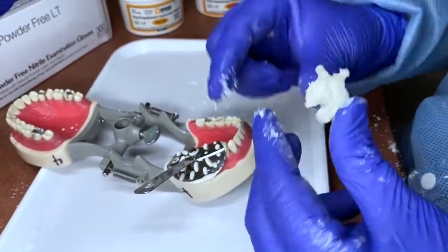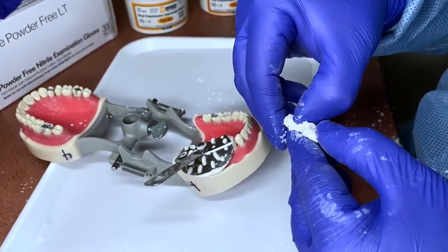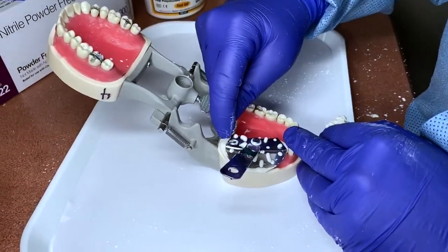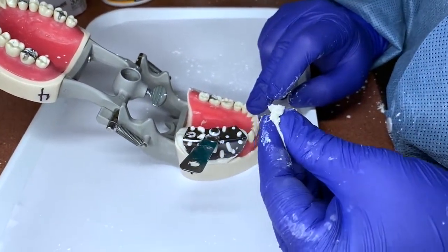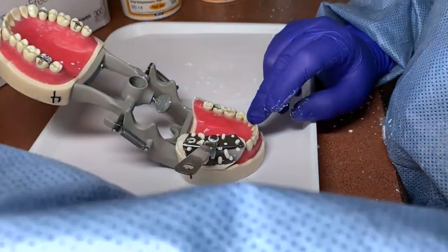It's almost there but still a little too soft. If you put your fingernail in and it squishes out, it's not ready. You can also feel around to see if it's hardened — inside the mouth it will set up more quickly due to the heat and saliva.